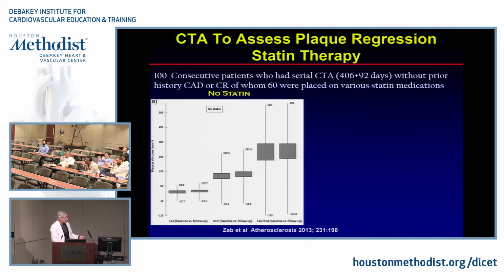Subsequently, there's been this other study by Matt Budoff, which has also looked at this, in a group of patients who had serial CTs. They had either no prior history of coronary disease, but they had a CT for chest pain symptoms, etc. And what you'll notice here in the patients who were not placed on statins, low attenuation plaque didn't change, non-calcified plaque overall didn't change, and calcified plaque really didn't change much over time.